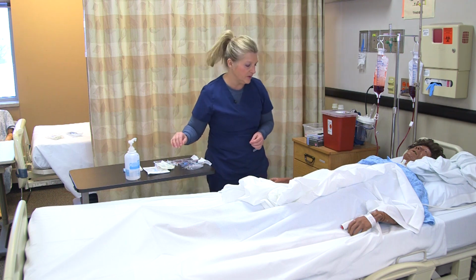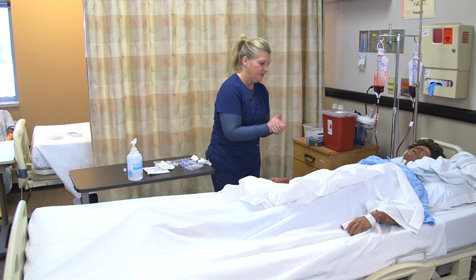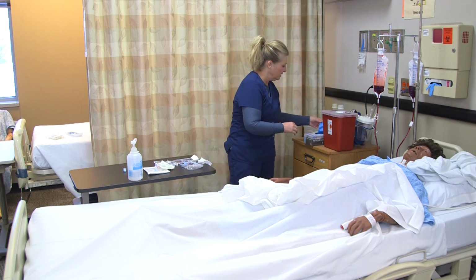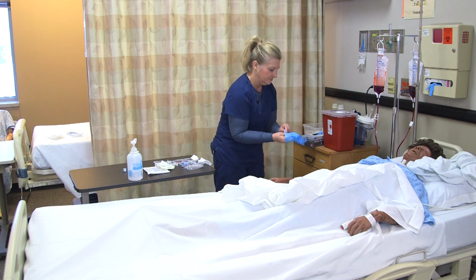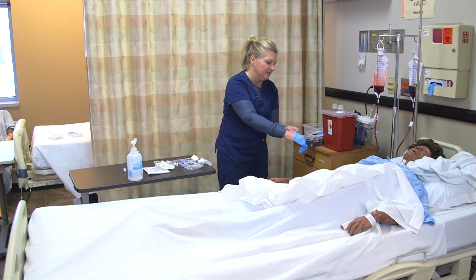All right, so now I'm ready to go ahead, and I'm going to wash my hands again. Always telling the patient what you are doing and explaining what you're doing. Okay, I'm going to put my gloves on here.